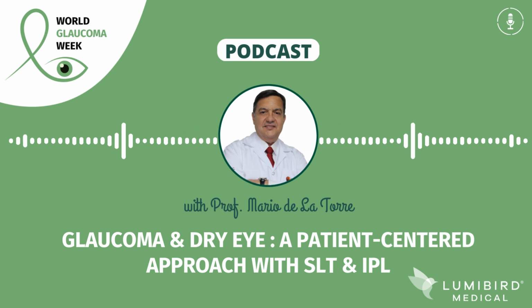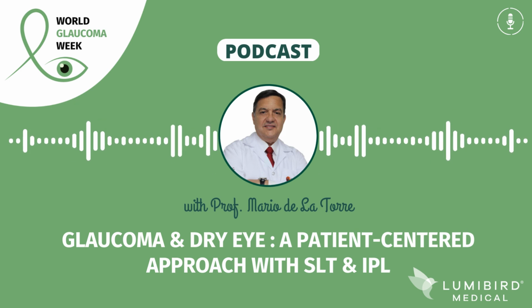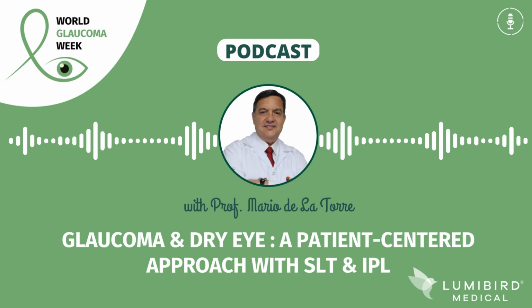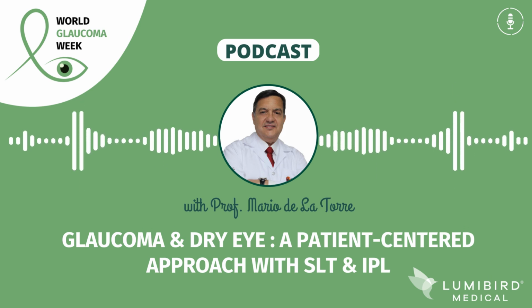Using this biomicroscope, this is the UBM, we confirmed that the angle was open and suitable for laser treatment. Some people say, okay, why do you use the UBM for that? You can use the gonioscopy, but gonioscopy shows you by indentation, by pressure, if you have an open angle. But about the mechanism of the angle, you have a better view of the angle with the UBM.